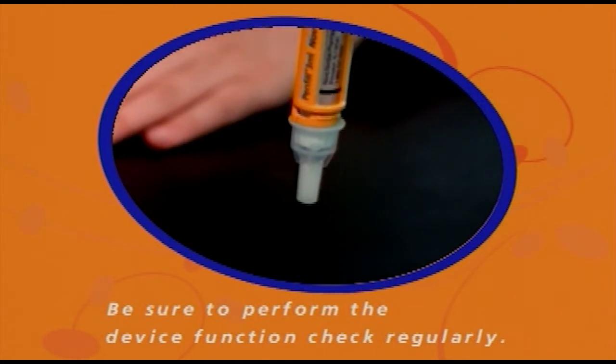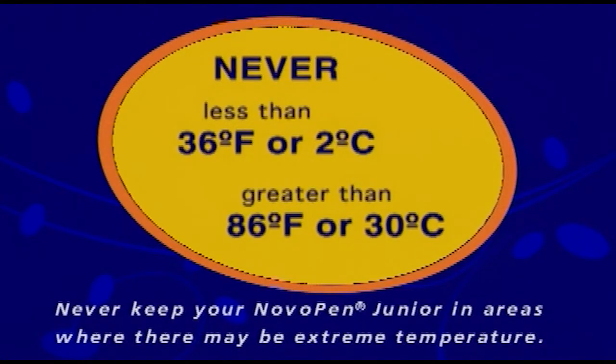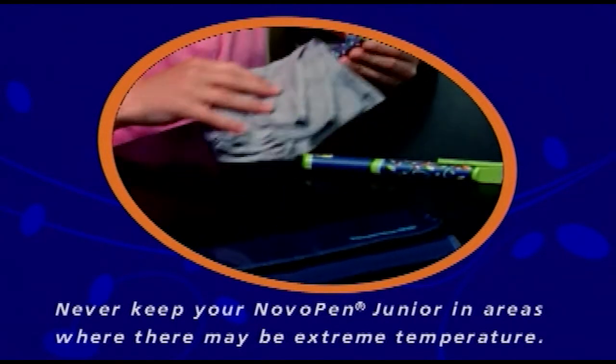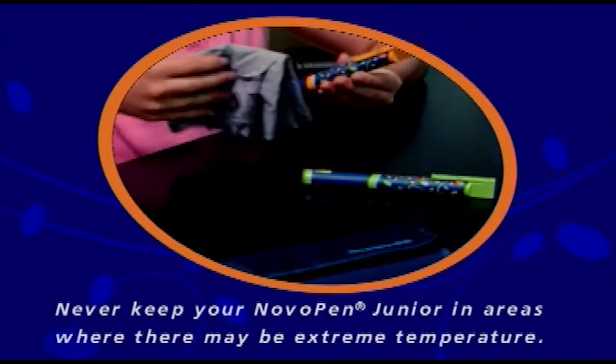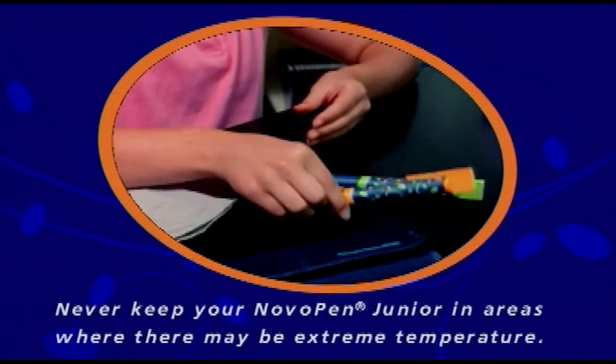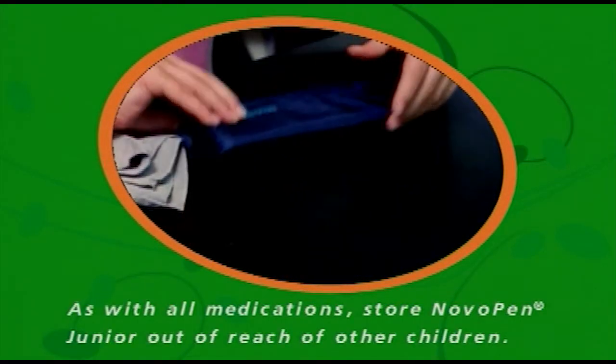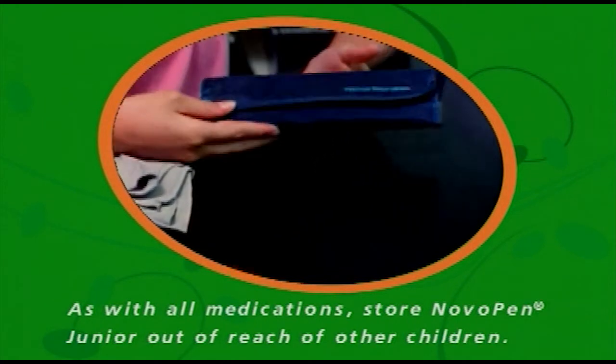Be sure to perform the device function check regularly, such as before starting a new box of pen-fill cartridges or if you think your NovoPen Jr. device is not working properly — but first, perform an air shot. If there's a pen-fill cartridge in your pen, be sure to store the device at room temperature. Never keep your NovoPen Jr. in areas where there may be extreme temperatures or allow it to be directly exposed to the sun. As with all medications, store NovoPen Jr. out of the reach of children.